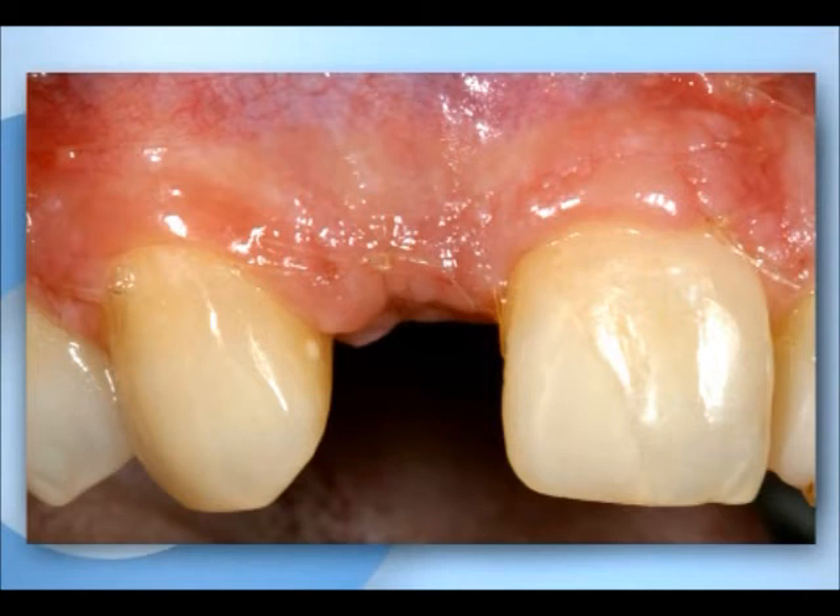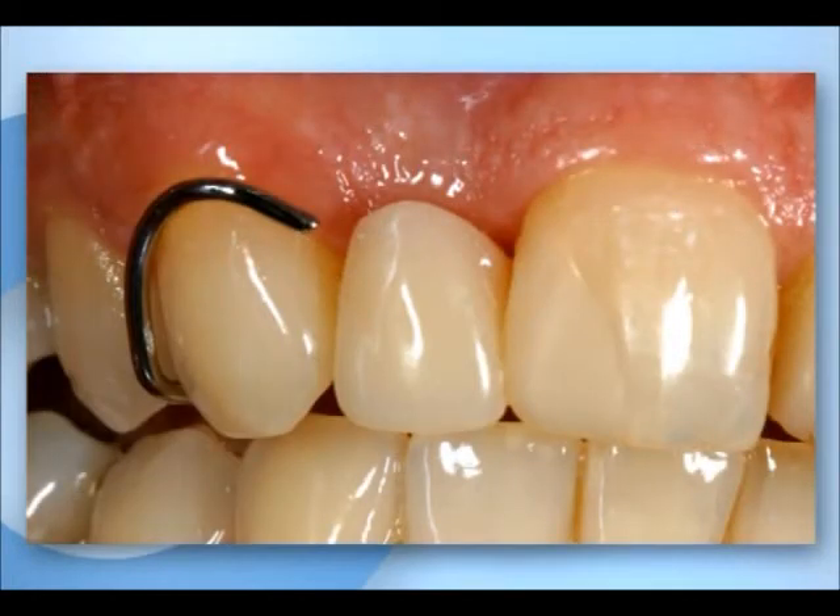The uneventful healing procedure is shown after one week. No swelling has occurred and the patient is free of pain. The soft tissue line is excellent and stable. Together with the vertical gain of soft tissue, it indicates a good long-term prognosis and the aesthetic success of the restoration.